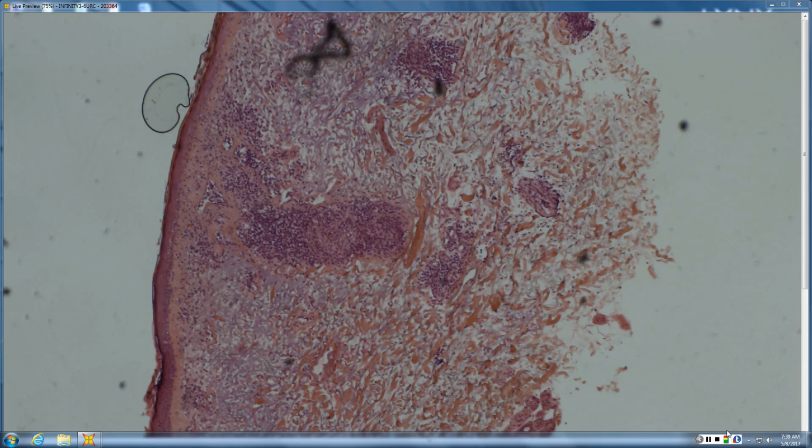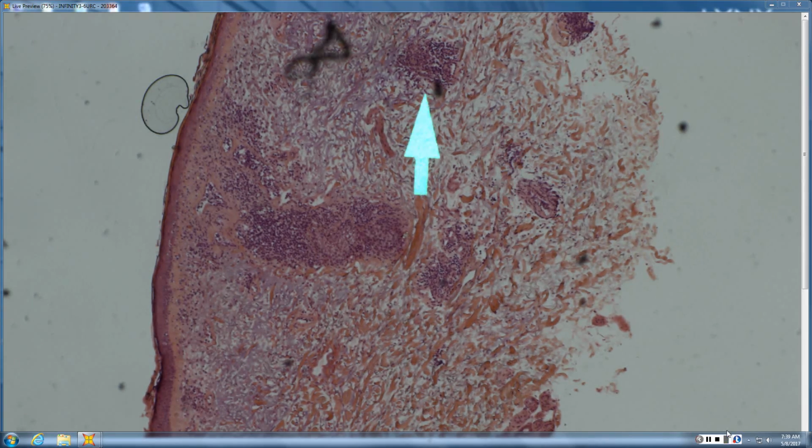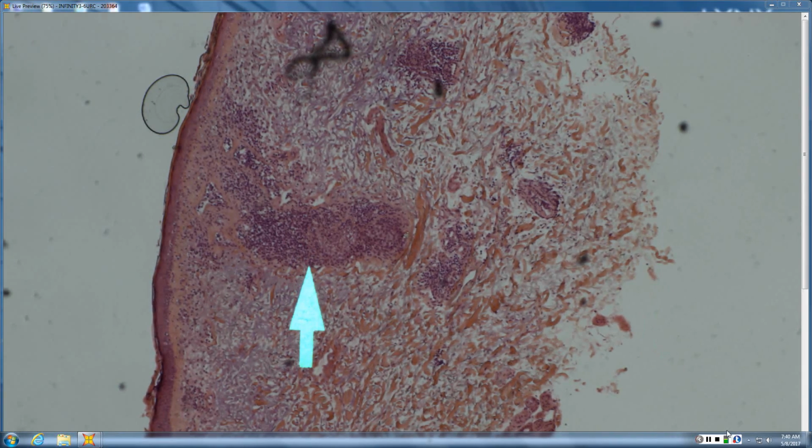Patchy lymphoid, vacuolar interface. Do you see any mucin out in the dermis? A lot of sun damage, but probably some of that is. Yeah, probably some of that is. And there is certainly space between the collagen bundles. But what I meant by the easy way is if you have vertical columns of lymphs in the dermis, not a whole lot does that. So lupus is your most likely. So then you start looking for other features.